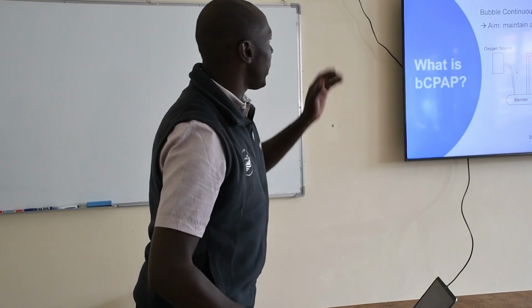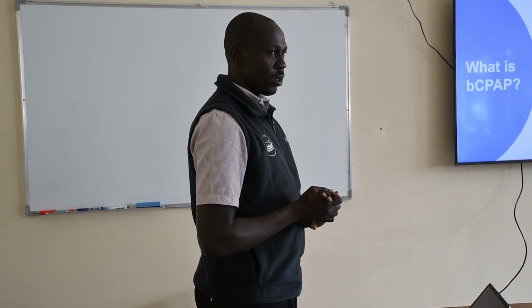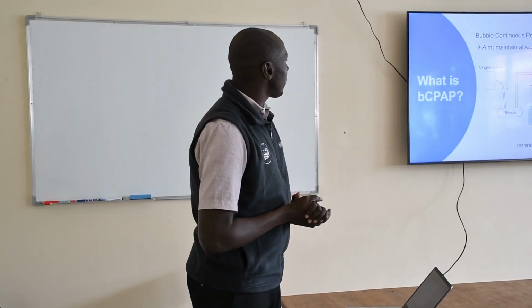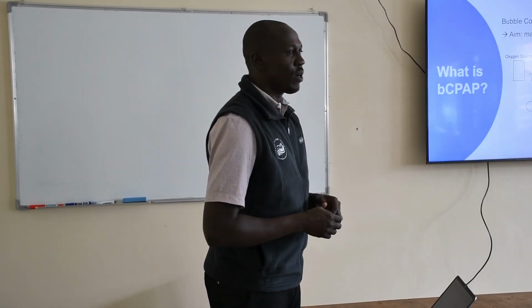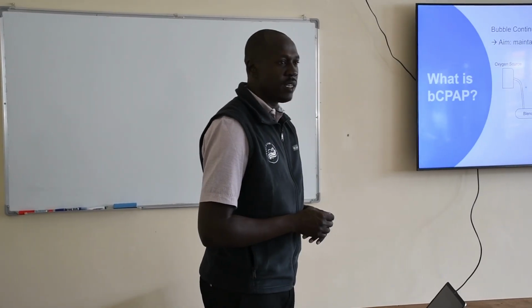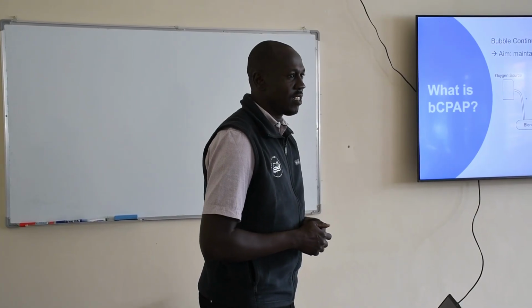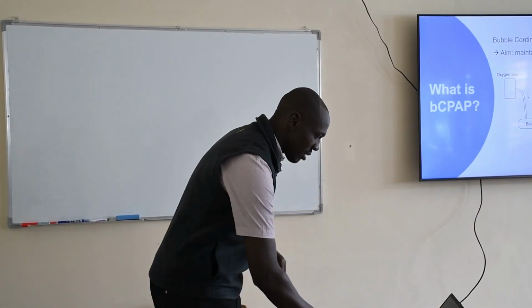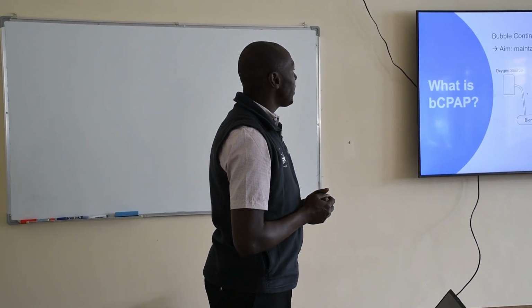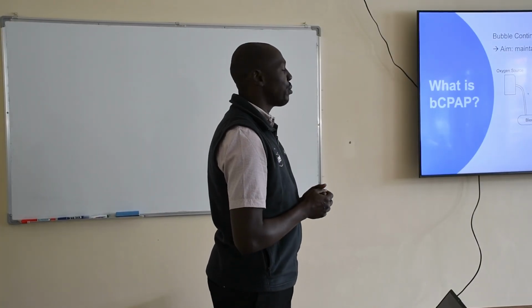So we'll go through the introduction to the bubble CPAP system. Can anyone tell me what they understand about this? About just the bubble CPAP system? What does it mean? What is BCPAP? So, BCPAP is bubble continuous positive airway pressure.